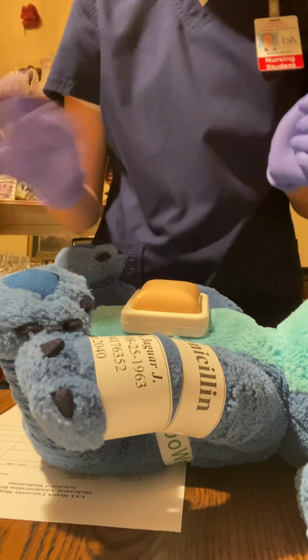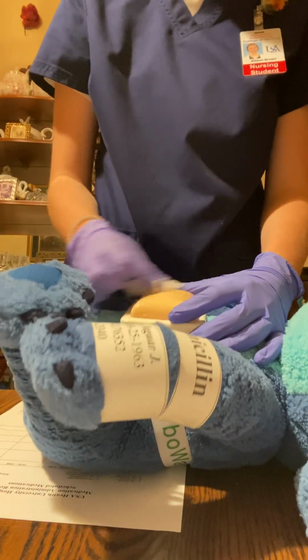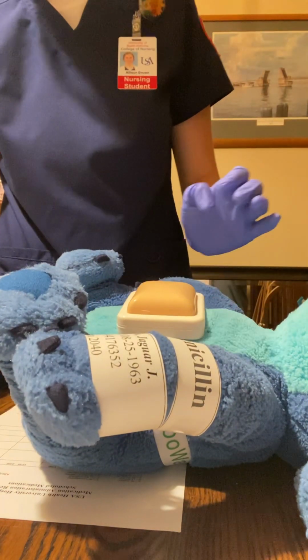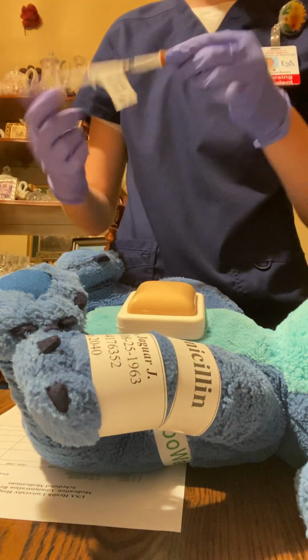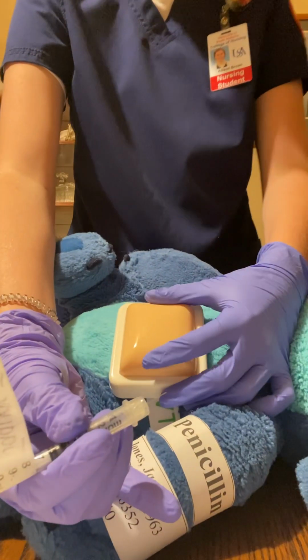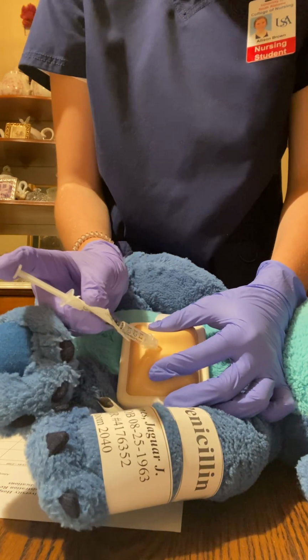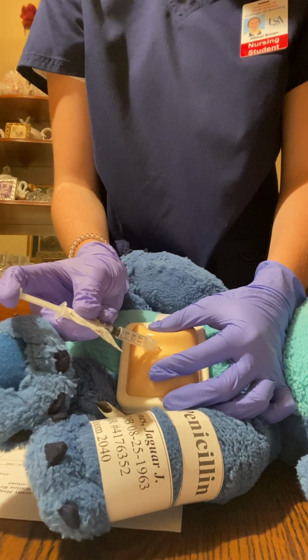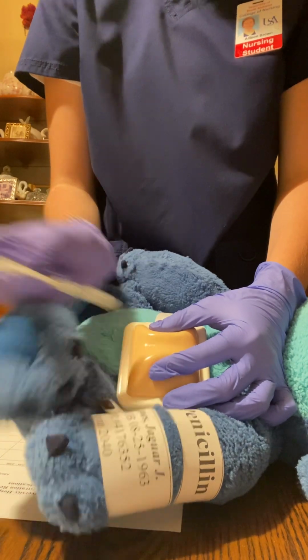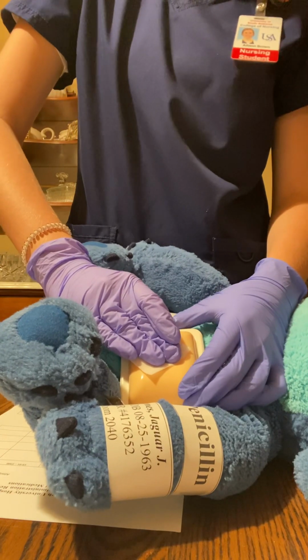So now what we're going to do is clean our injection site from the inside out. And then, like I said, we're doing a 45-degree angle. So I'm going to pinch and inject. And then I'm going to hold over that with my alcohol pad.